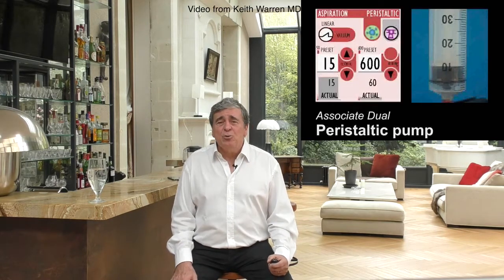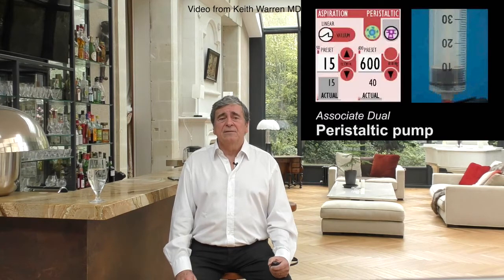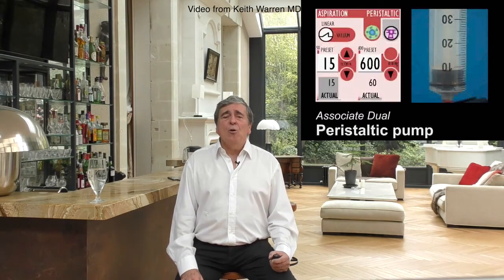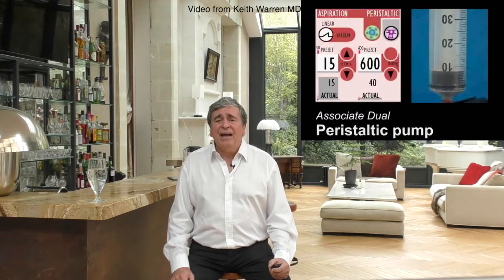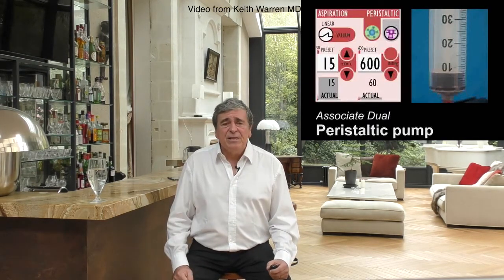It will not increase or exceed the infusion flow rate. In Venturi, if the operator chooses a high vacuum, equivalent to the vacuum used by the volumetric machine to obtain this high flow rate, when he moves from the vitreous to the BSS, the flow will reach too high levels.